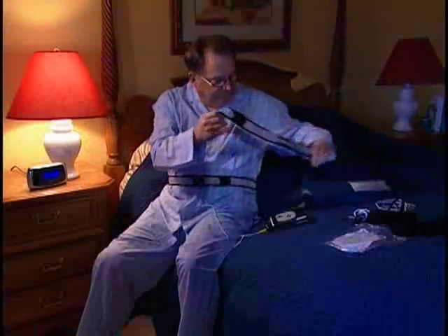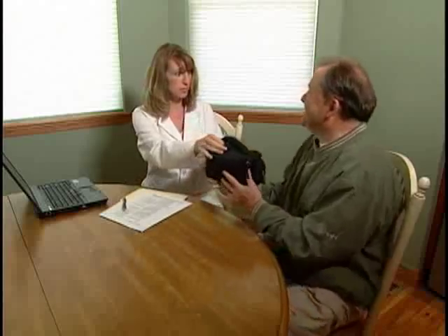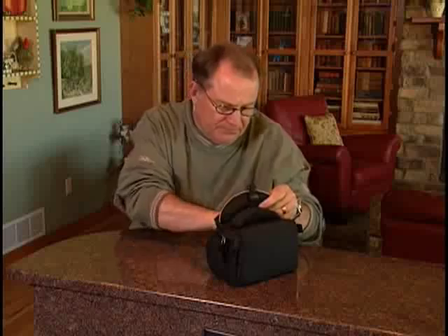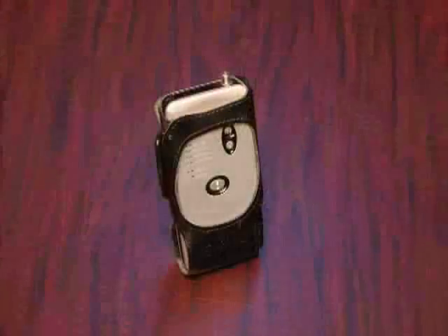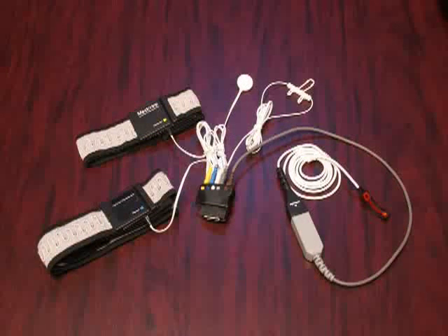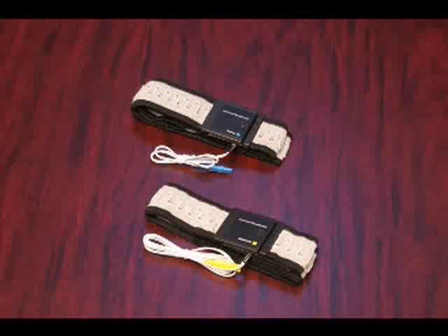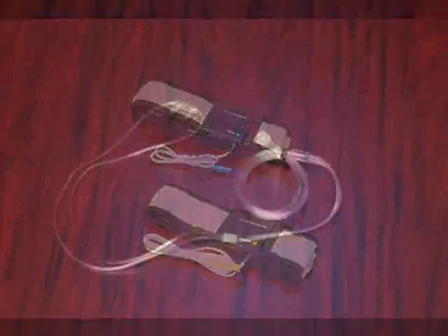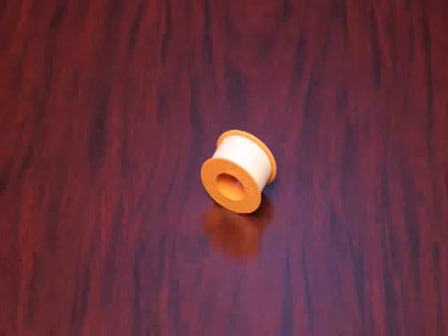The Embletta recorder, sensors, and straps may already have been set up for you by your Embletta provider. Please follow only the steps that apply. Now that you're at home, you will need to unpack the device and sensors to ensure you have the following items in your carry case: the Embletta recording device, the Embletta strap, the sensor proxy with sensors attached, the Embletta hookup card, 2 respiratory effort belts, thorax and abdomen, a nasal cannula, an oximeter with finger wrap, and medical tape.